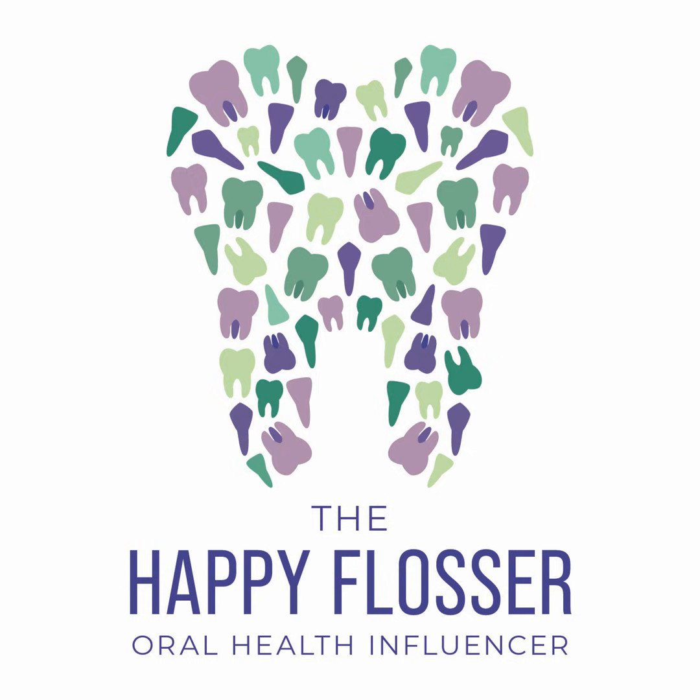You may get some overlap here on the first and second molar, but the roots are typically tipped here, so you want to make that minor adjustment, keeping in mind that you may have to make an additional shot for the wisdom tooth there. Not a problem. If you anticipate and you always change as you go, make sure you get the apices of every single tooth in your complete set.